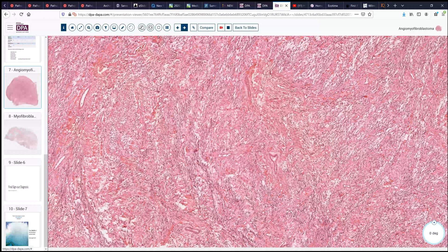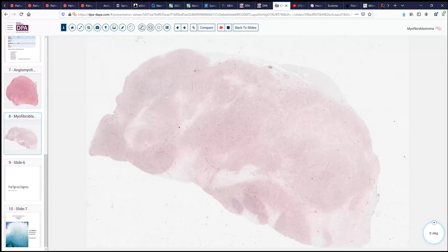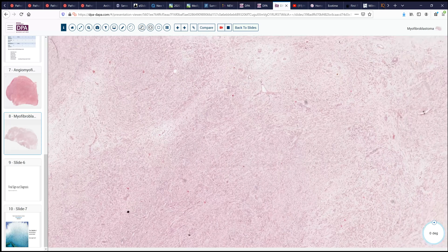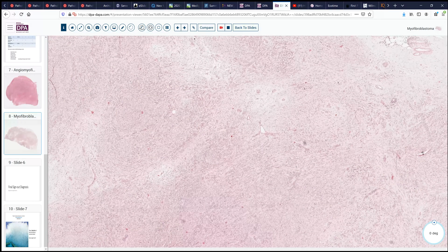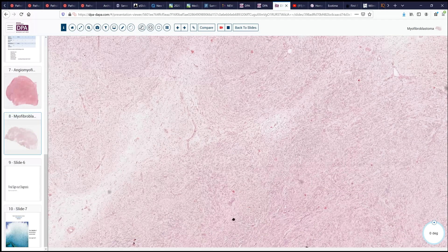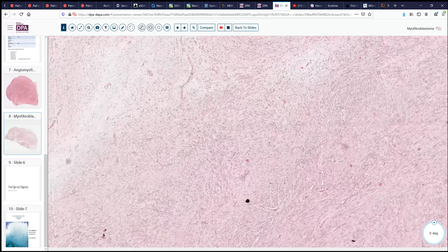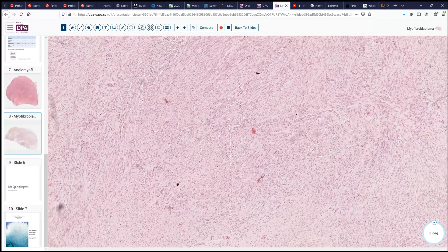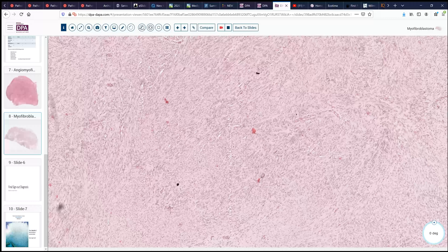In contrast, myofibroblastoma may have a little bit more myxoid appearance in some areas with some nodularity. But it doesn't have quite the same myxoid character, and again we don't see that variability of vessel sizes — just a minimal amount of vasculature. So it's not really a very vascular tumor, and appropriately, it isn't an angiomyofibroblastoma. That gives you a flavor for how these tumors are different — even though they can be found in the differential and present in a similar location, their histologic findings will almost immediately allow you to exclude them from consideration in the aggressive angiomyxoid tumors.